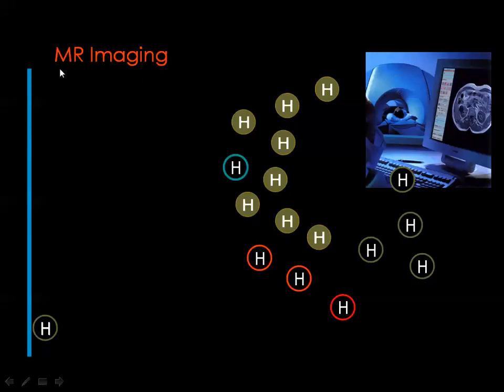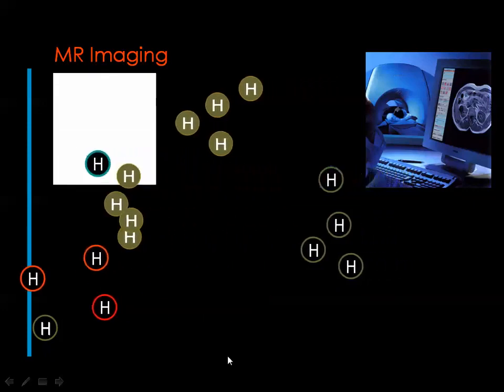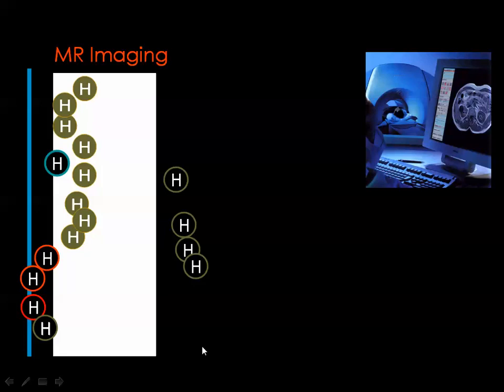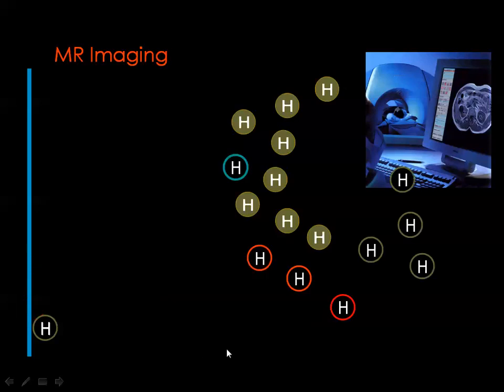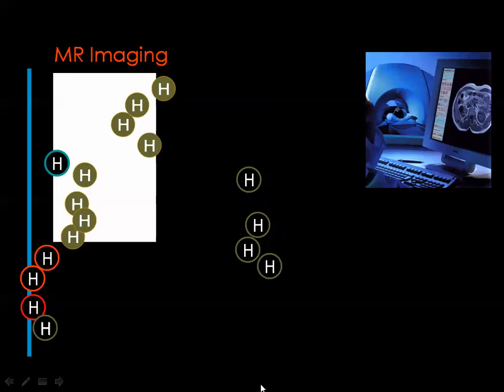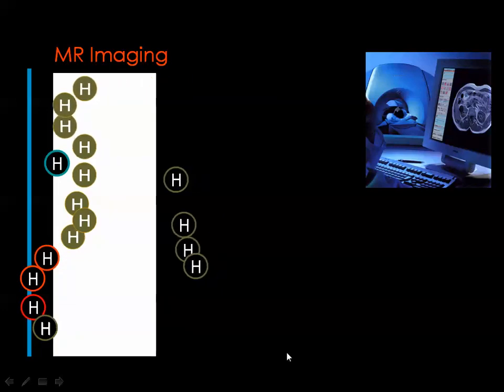We applied the radio frequency, then the hydrogen has moved, and now we will put off the radio frequency coil, and we will open the camera, which will image the hydrogen protons while they are coming back. Then look at it once more. The camera is represented here by this white band.